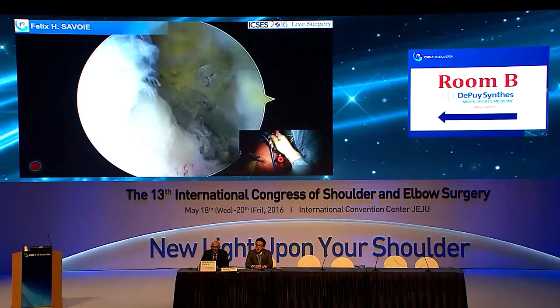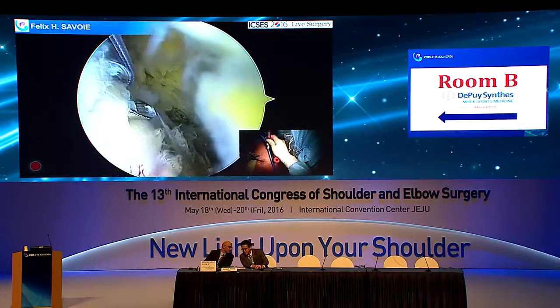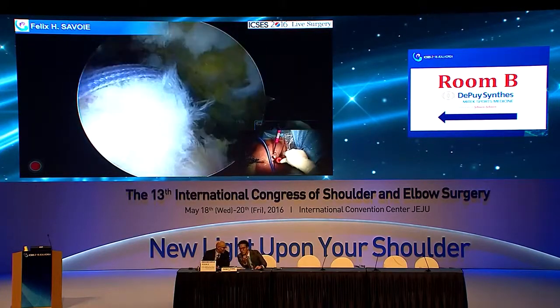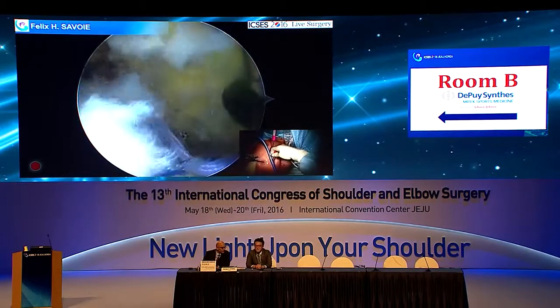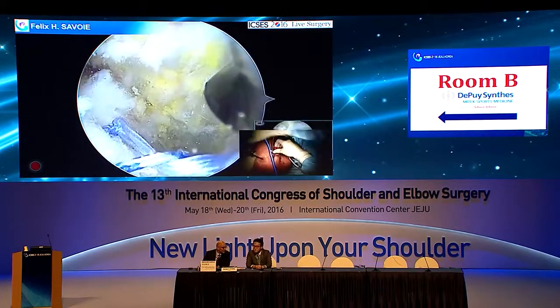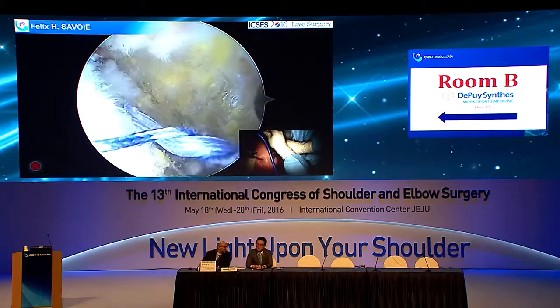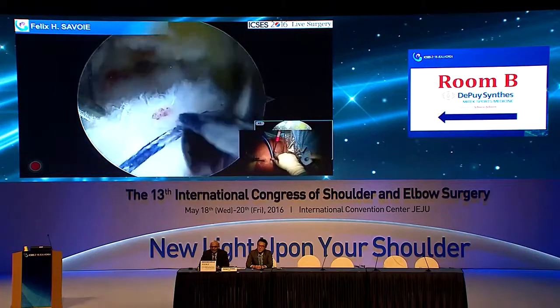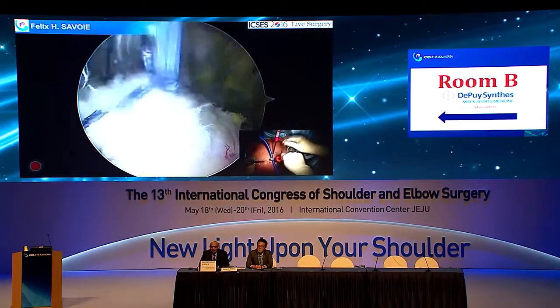So I'm adding a step here. So this is coming through, right? And so what we'll do is we'll take these sutures, which are coming out here. We'll move one of them way over there. Can you hold that like that for just a second? No, this one. Just keep that pushed down. Let me have the lobster claw grabber for a second.